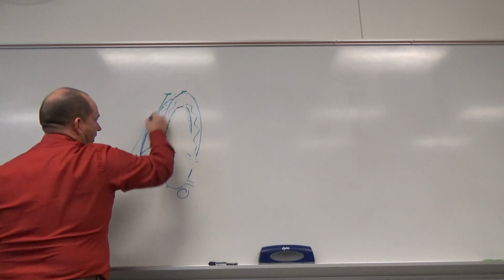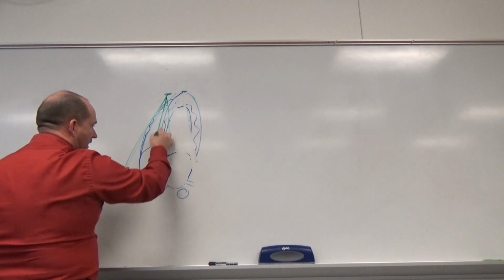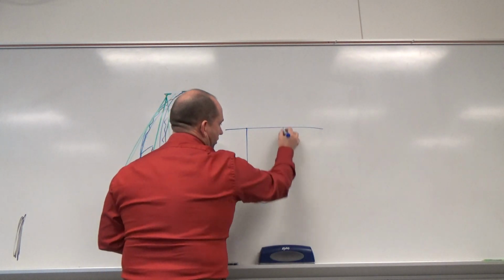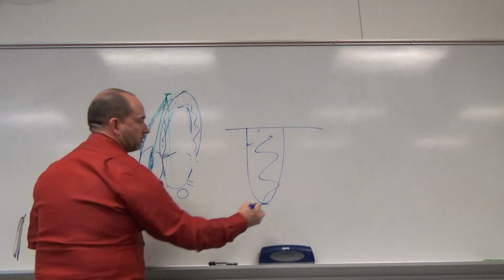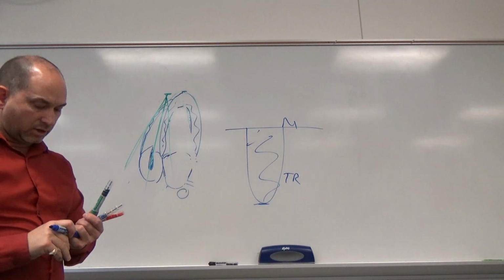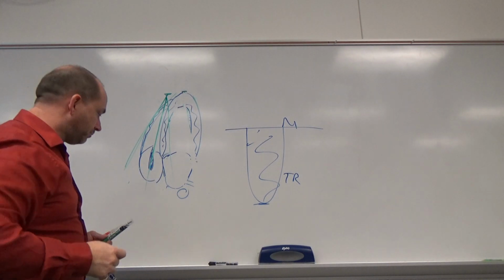Rock it so that it lines up straight over that, and you're looking straight down in. That's going to get us the best Doppler angle. And once again, for the third time, we're now going to take the spectral sample of that regurgitation and measure its maximum velocity. That's the TR jet. Again, I'm not all that concerned about the EA wave of that because tricuspid stenosis is not that common. So that's what we're going to do on a regular routine basis for echo.